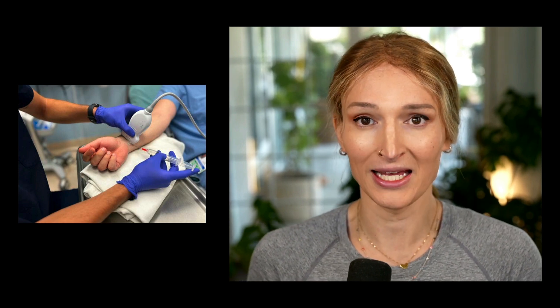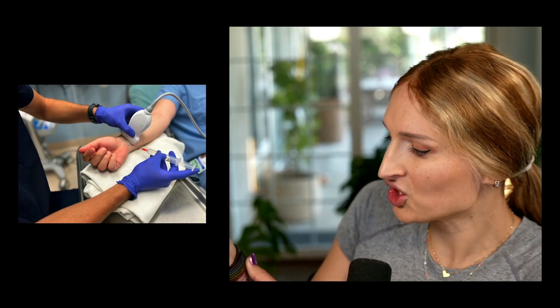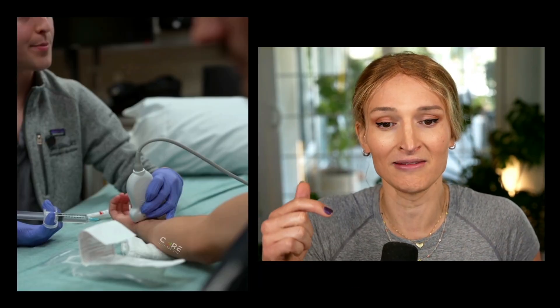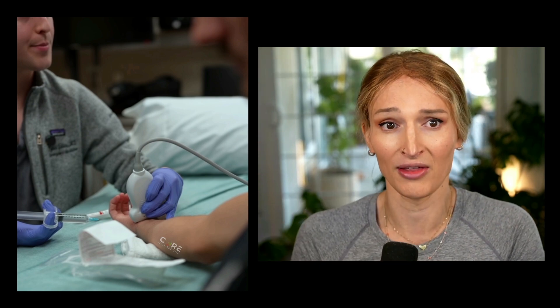As far as positioning, we want to make sure to have our patient in a comfortable orientation with the palm up. Preferably they're in a bed and the arm is slightly abducted, with some pillows or towels underneath the wrist to prop it up just a little bit. We also want to have the ultrasound screen itself in the field of view.